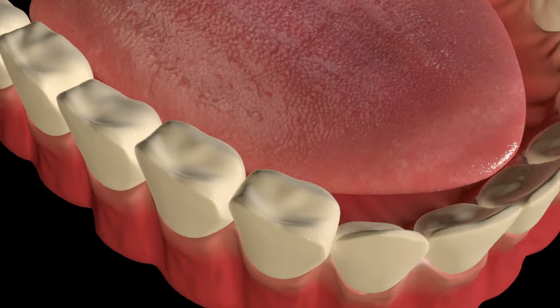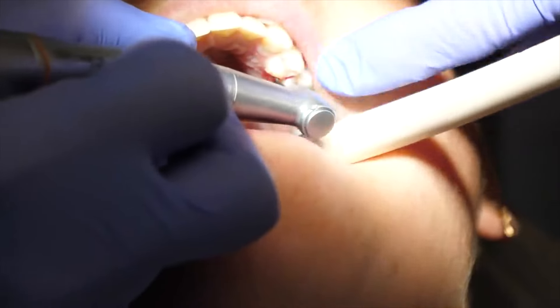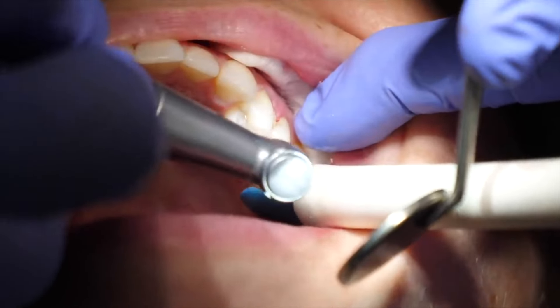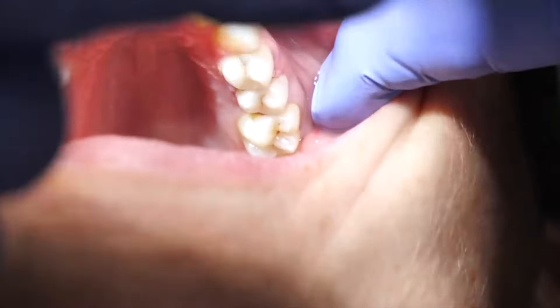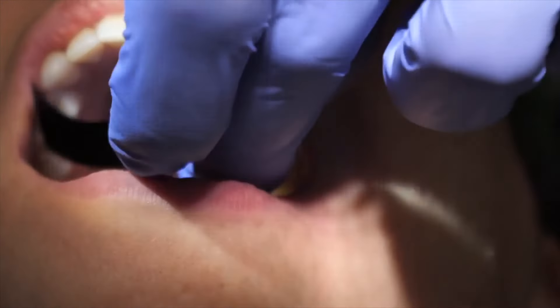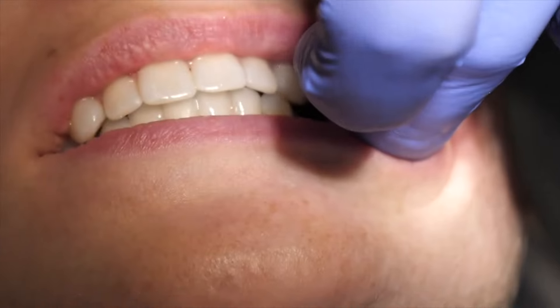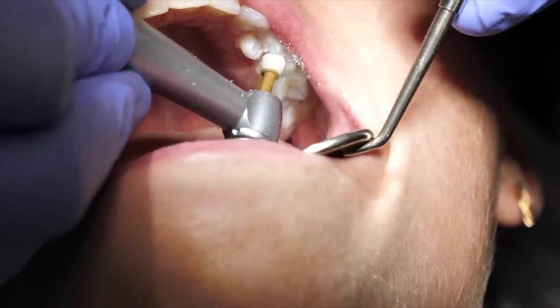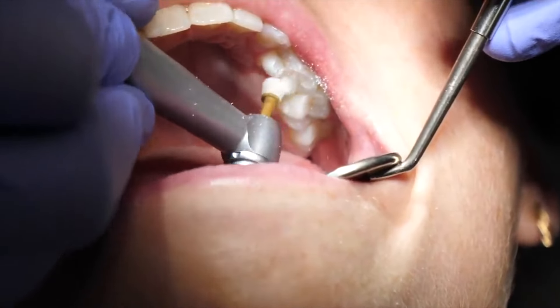It looks pretty nice — good as new, like nothing even happened there. Once they are done, if you did have any wedges, bands, and clamps around your tooth, they will remove these now. They might also remove any sharp edges with the drill if necessary. They'll floss around the tooth, probably with a string floss, and then check the bite with the biting paper, also known as articulating paper. And lastly, they will polish it so it's nice and smooth.